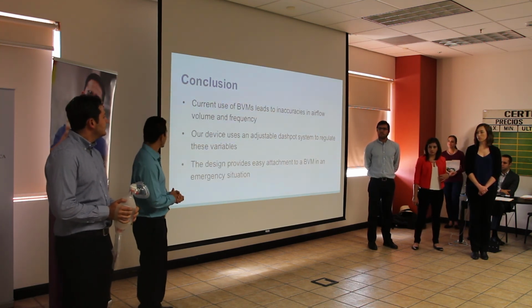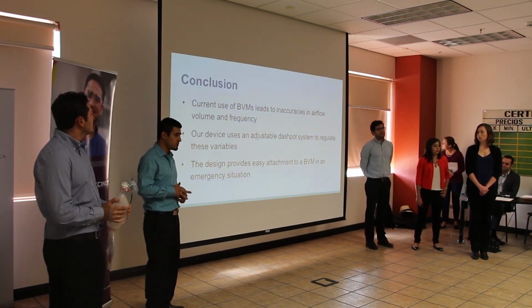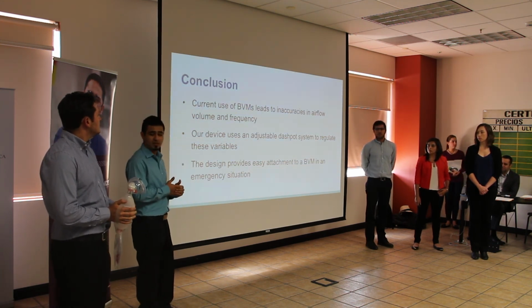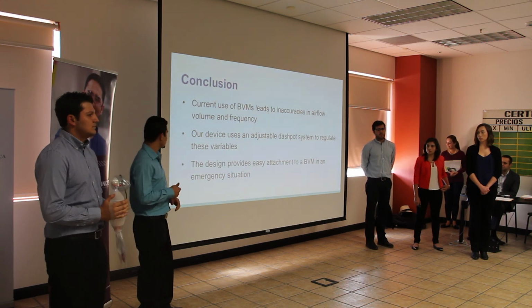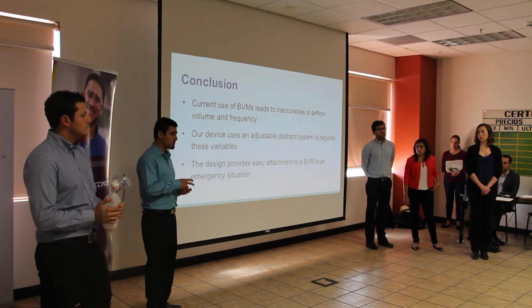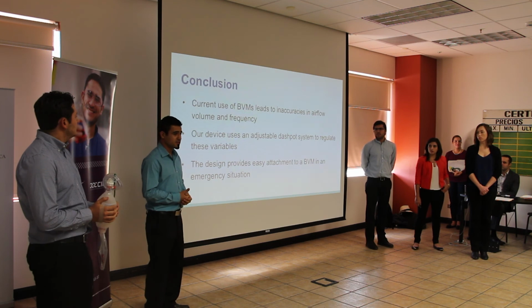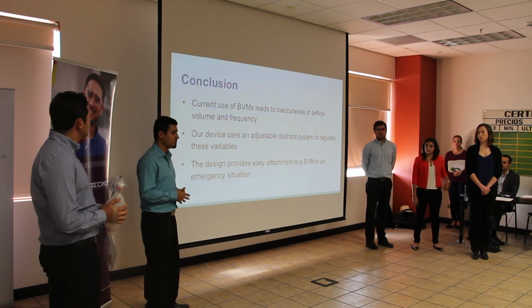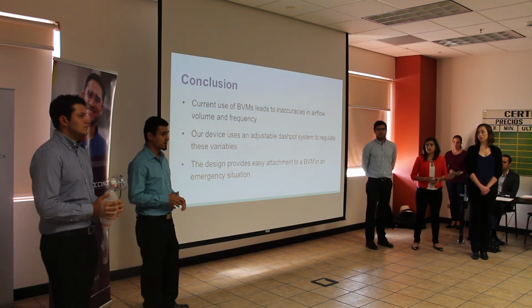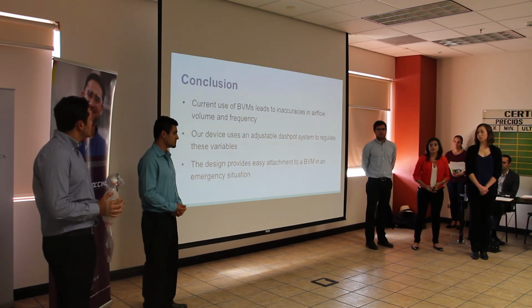As a conclusion, current use of the BVM led to inaccuracies in airflow volume and frequency. The use of a dashpot system regulates those 2 variables, and the design provides easy attachment to the BVM in an emergency situation. As a summary, this device will help paramedics, doctors, and all persons that use it to reduce inaccuracies in the airflow volume and the frequency when it's used.